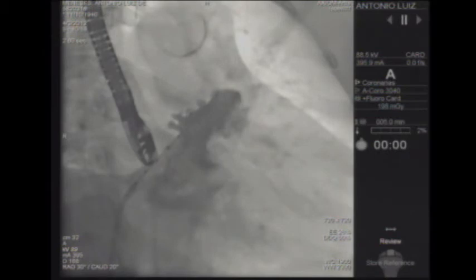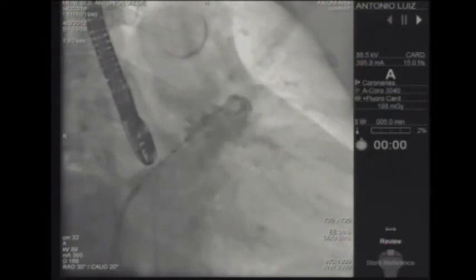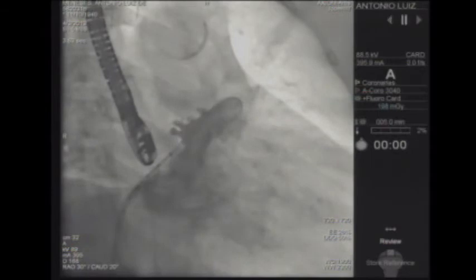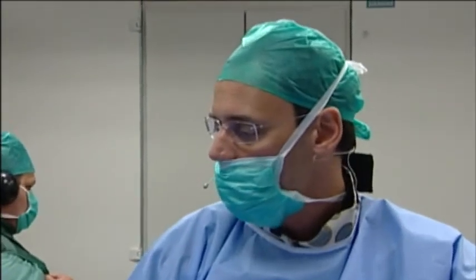So because we had about 18 to 20 millimeters, the landing zone, in both projections, I'm going to pick up an ACP, a 22 millimeter ACP. We have to take into consideration that the ACP should be anywhere between 2 and 4 millimeters larger than the landing zone. So I think we have good correlation between the echo findings and the angio findings, so I'm going for a 22. Okay, so now we are advancing a 13 French sheath.